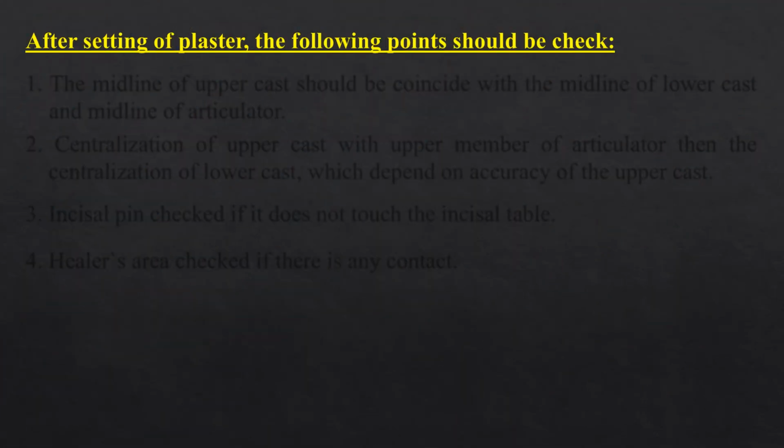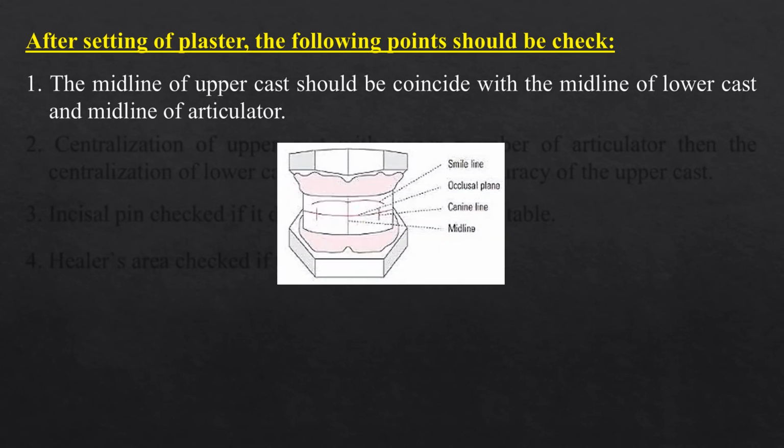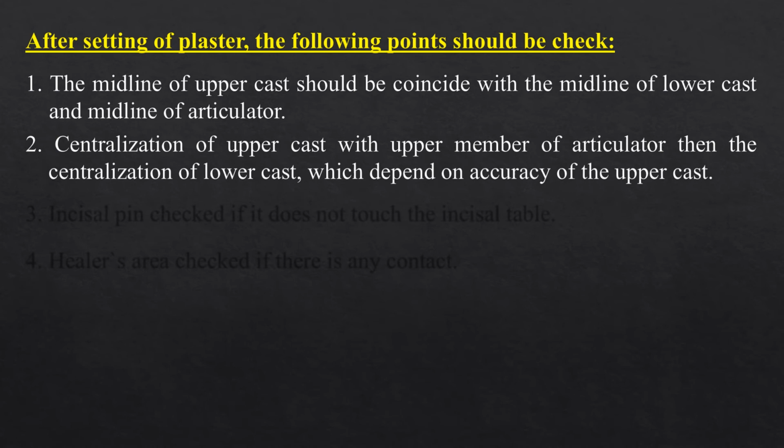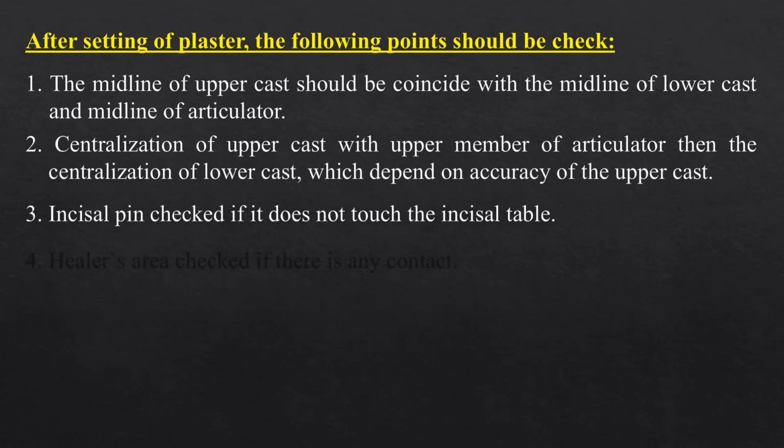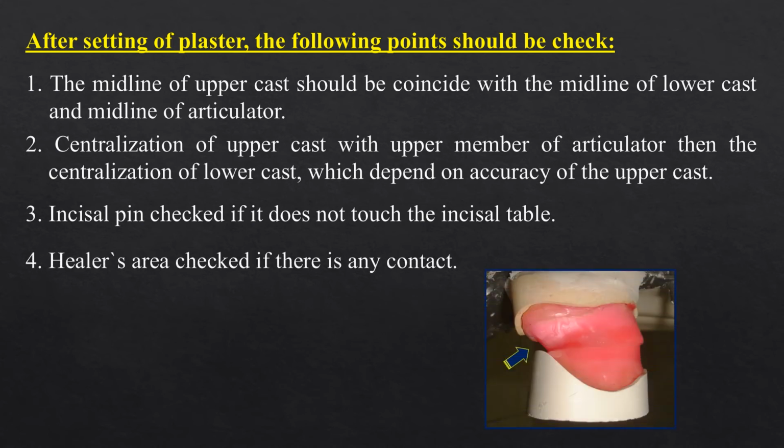After setting of the plaster, the following points should be checked. Number 1. The midline of the upper cast should coincide with the midline of the lower cast and the midline of the articulator. Number 2. Centralization of the upper cast with the upper member of the articulator, then the centralization of the lower cast, which depends on the accuracy of the upper cast. Number 3. Incisal pin: check that it doesn't touch the incisal table. Heel area: check if there is any contact.